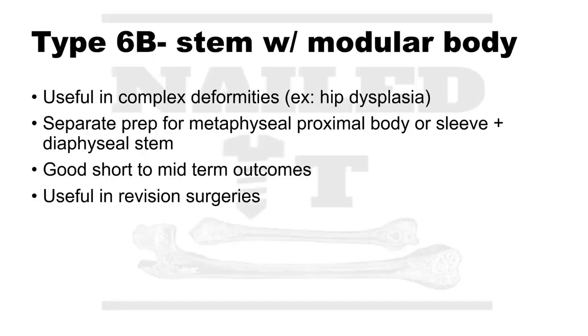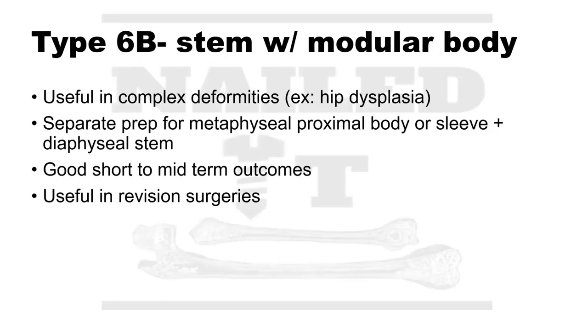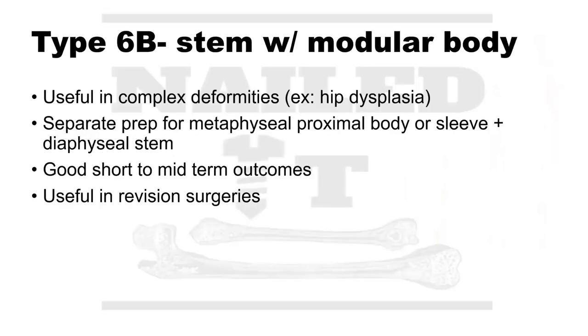Okay, so that is again a modular stem you're going to use, like you said, for more complex patients with different abnormalities in anatomy and different levels of dysplasia. And again, it's good because you can fine tune your anteversion, your length, offset, whatever you need to. The modular necks are not used as often, but the modular bodies are.